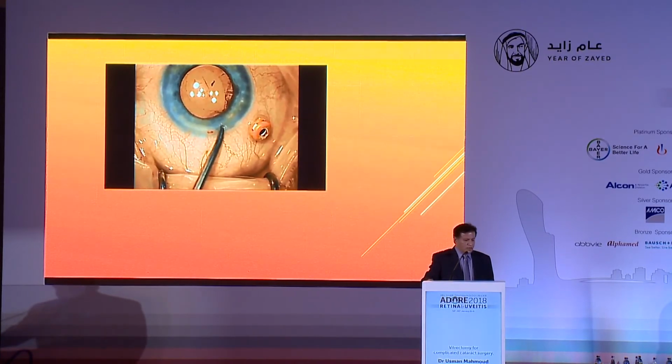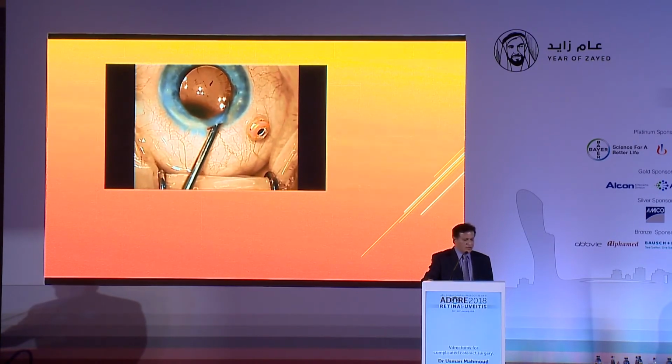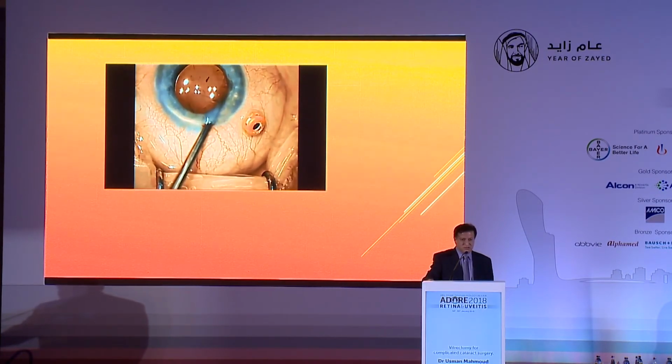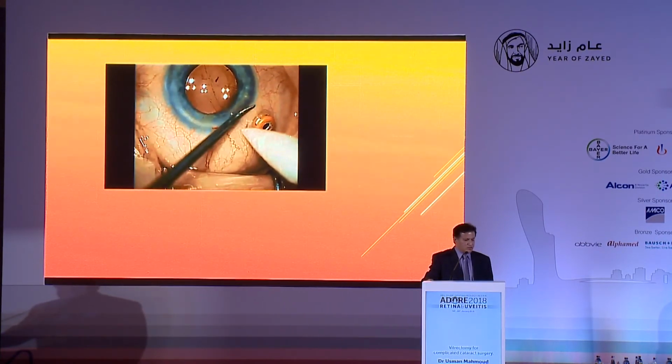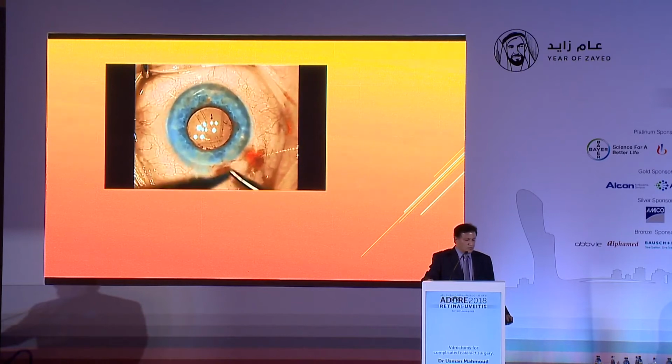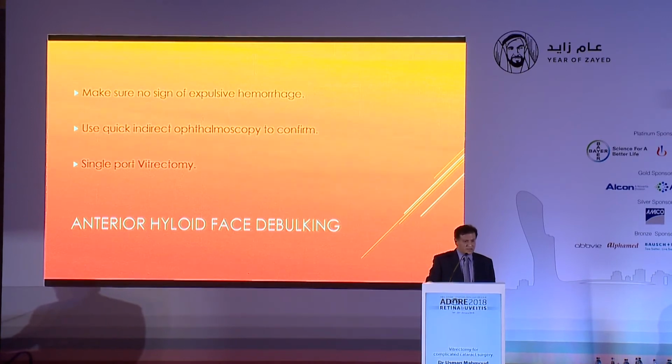And then I looked about in the anterior segment, and there was a vitreous tug coming at about 11 o'clock position, which was removed with the scissors, and then the procedure finished. Basically, in this kind of situation, there was BSS misdirection because there was a pre-existing zonular dehiscence which was not noted before.